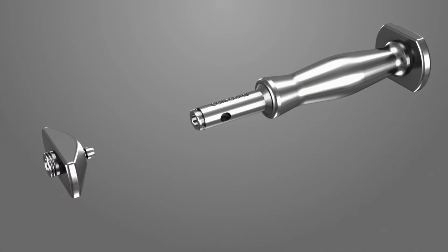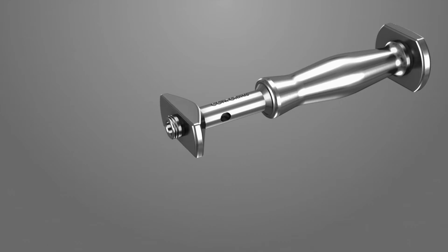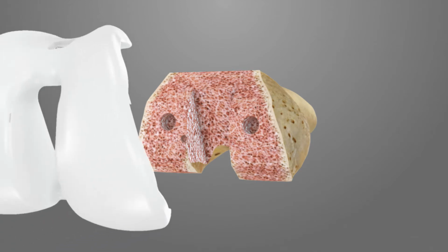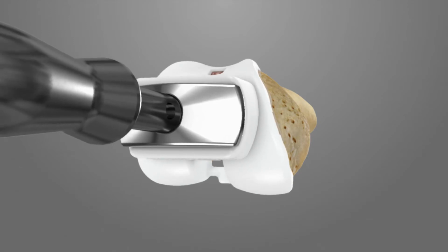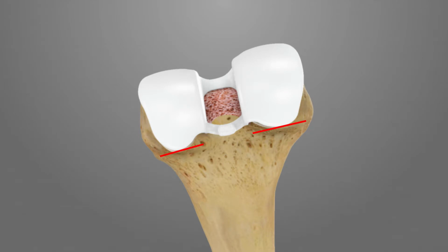Assemble the impactor head onto the impactor handle by connecting the two pieces at the mating surfaces. Then connect the femoral impactor iJig onto the assembly. Place the femoral trial onto the femur and impact it into place. Remove any remaining osteophytes, including those on the posterior femoral condyles and on the posterior intercondylar notch. Also, remove any bone in the transition area between the femoral trial and the posterior condyles.